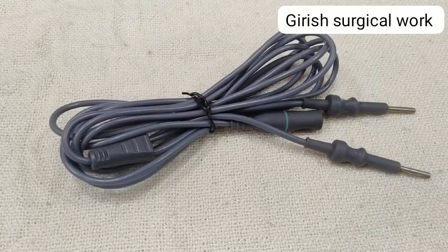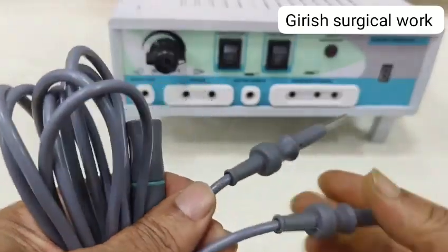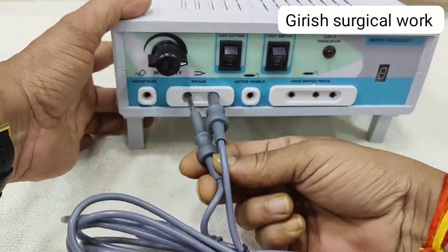This is a silicon bipolar cable, called reusable autoclavable, which is used in surgical cautery. The two banana jack pins will be going to the machine-end port at the bipolar end.